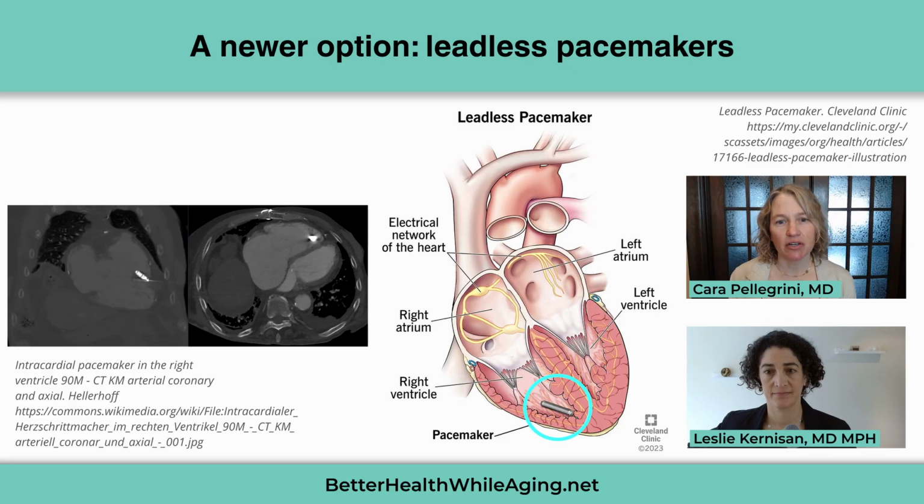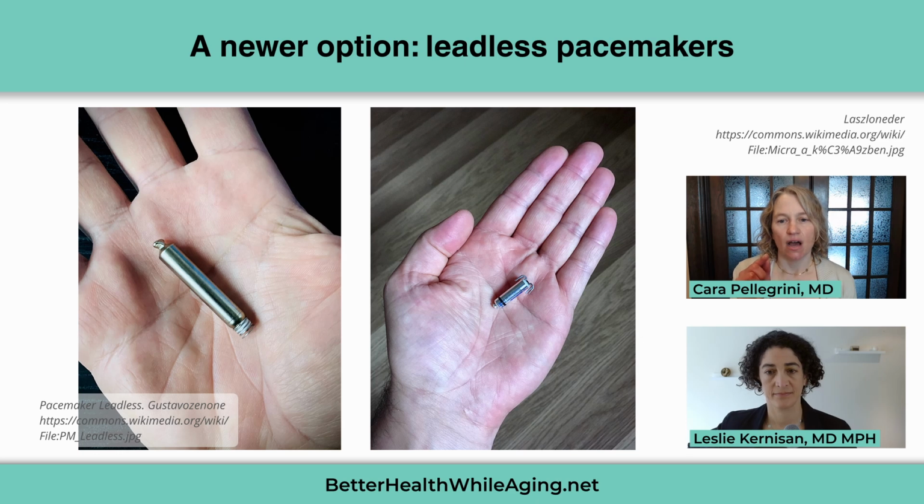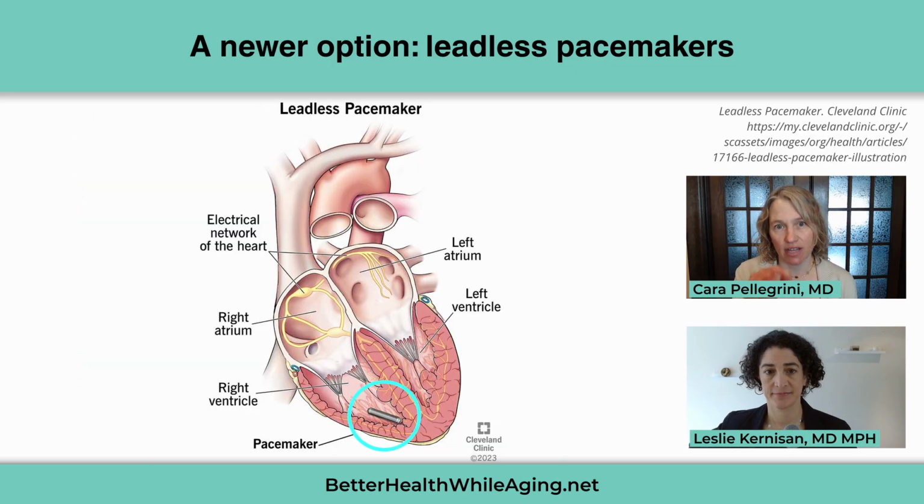And the leadless pacemaker that you might be able to see on your screen here is a little metal capsule that is a self-contained device. The battery and the computer are all contained in there. And at one end, the non-button end, that either has a screw or little fish hooks, there's a little electrode right in the center that touches the heart tissue, and that allows the sensing by the device of the person's intrinsic electrical activity to occur, as well as the output from the device to the heart of that electrical signal to stimulate a beat.